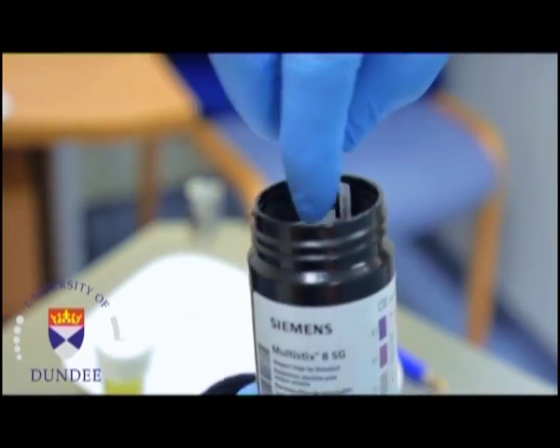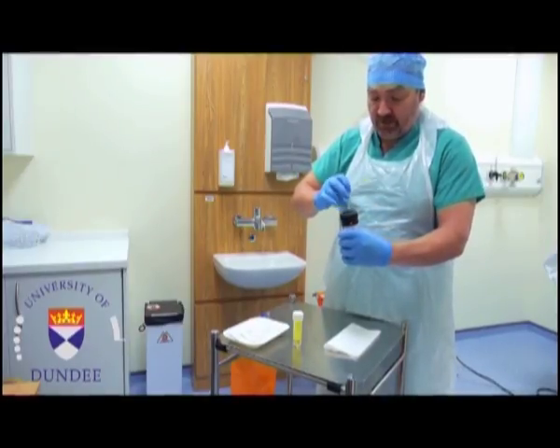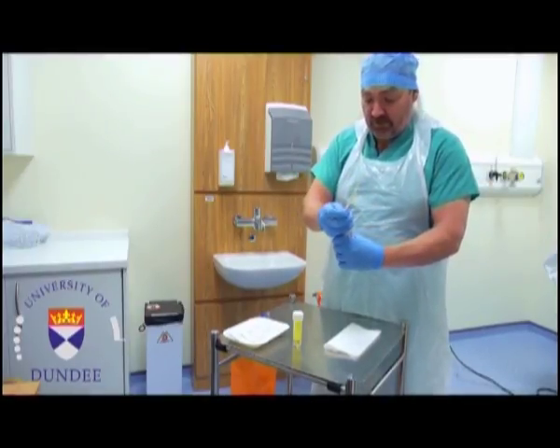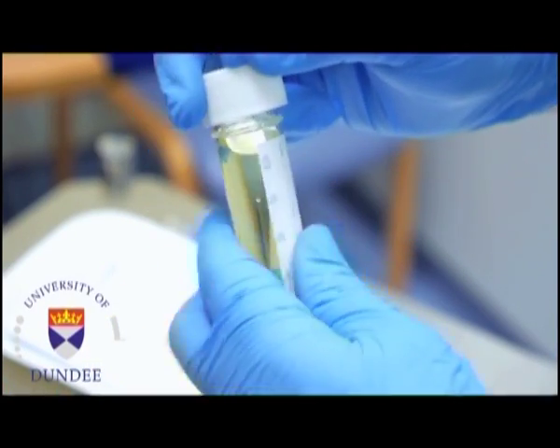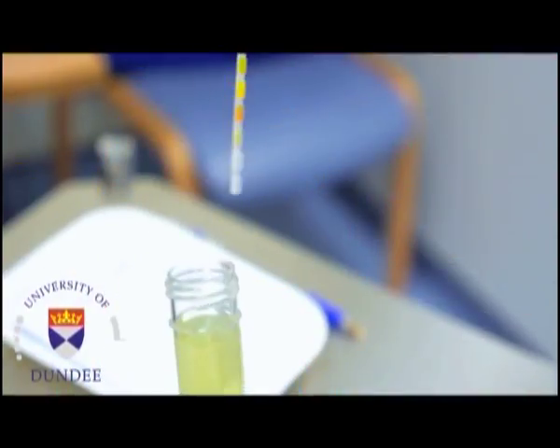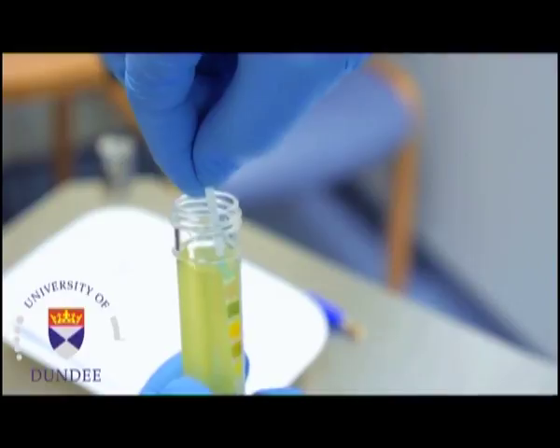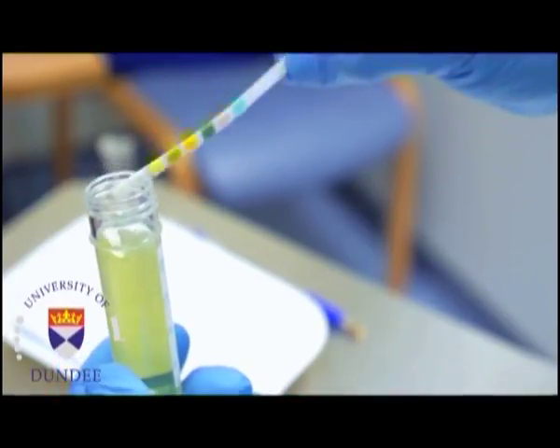Urine test results should always be interpreted using the reference range provided by the laboratory that performed the test, or using information provided by the test strip or device manufacturer. In addition to various substances, other tests include a description of color and appearance.